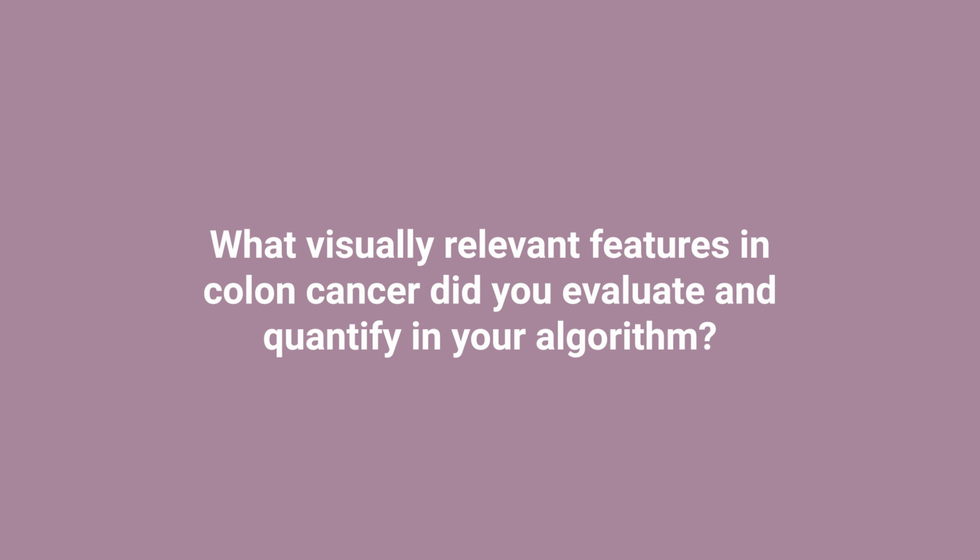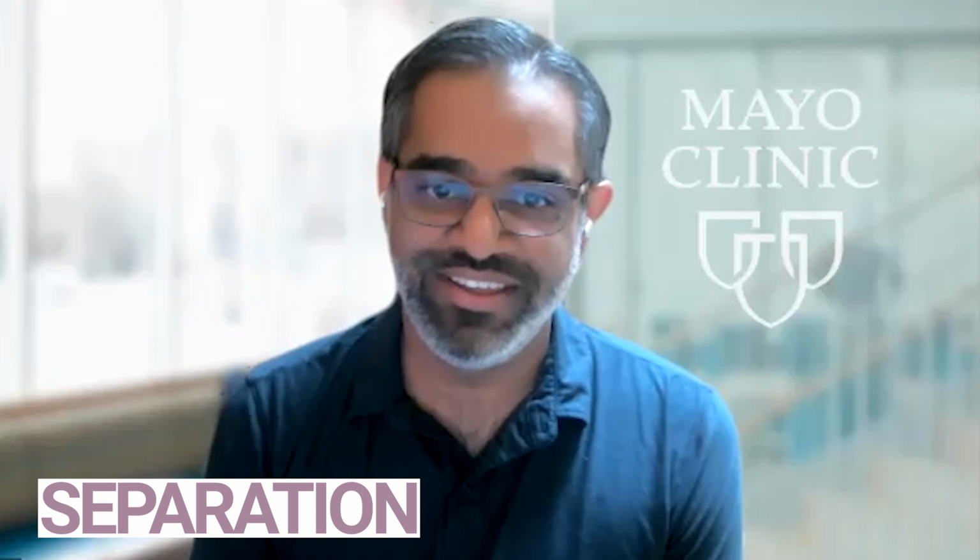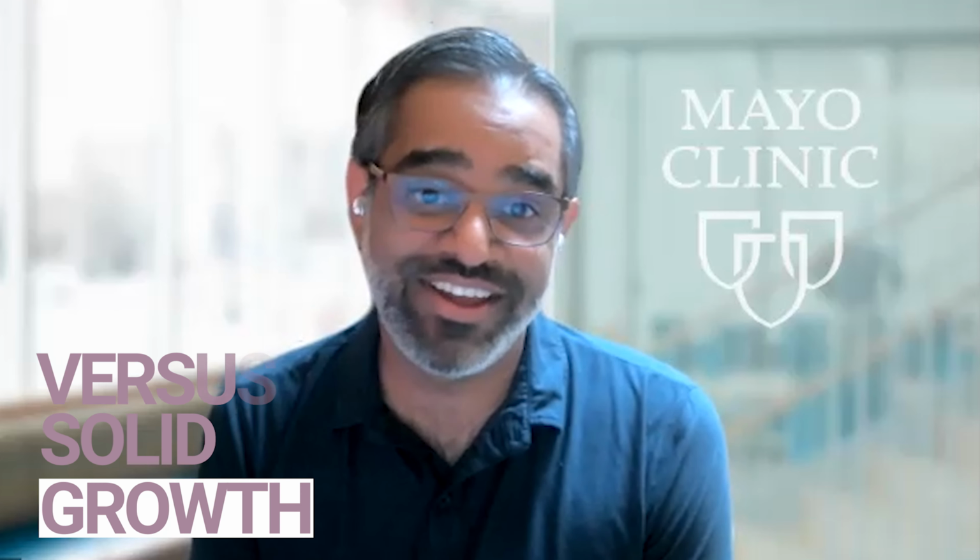So what did you evaluate? You said that you visually evaluate certain aspects, certain regions, certain cells in colon cancer, but you don't report. What did you quantify in your algorithm? Yeah, so it started very straightforward. First, let's identify the carcinoma region and separate it from stroma. But then within the carcinoma region, we know that there are various grades, solid growth versus glandular growth. So I used the tool to sub-stratify those areas. Signet ring cell cancer, get that out and quantify the percentage of signet ring cells.